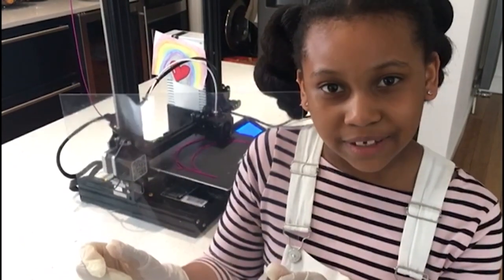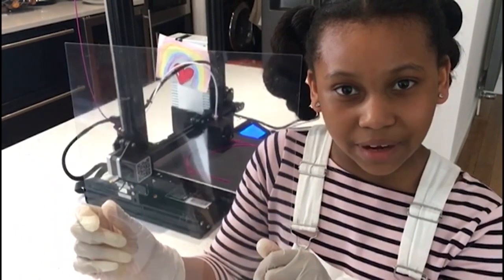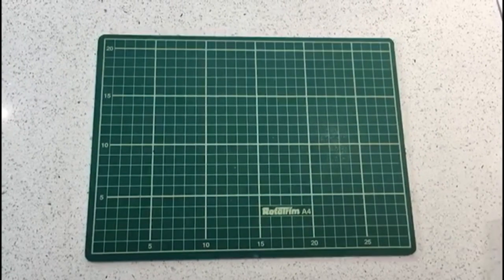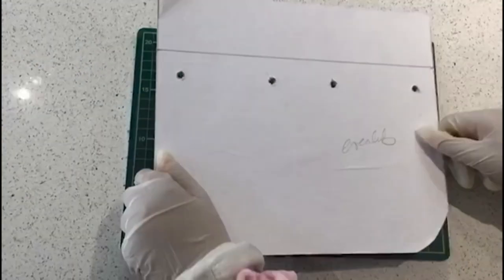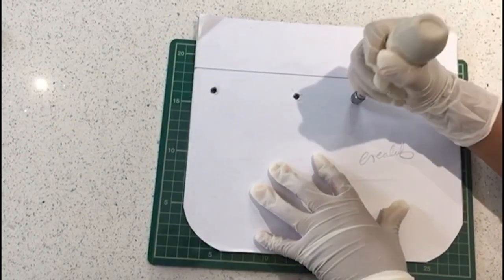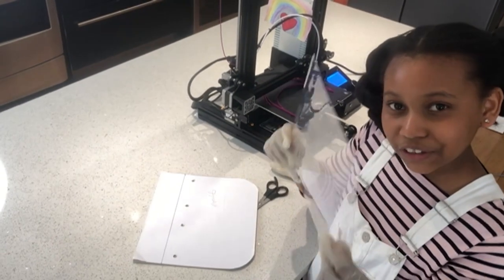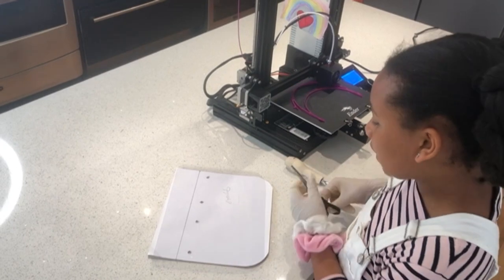So while that's printing, it's time to make the shield part of the visor out of this A4 plastic acetate. Don't forget to put on some gloves. Using your cutting mat, you're going to place your plastic acetate on top of there. Then you're going to place your template on top of that so that you can punch some holes in it. Then you need to place your acetate on top of your template and cut it so that they're the same size.